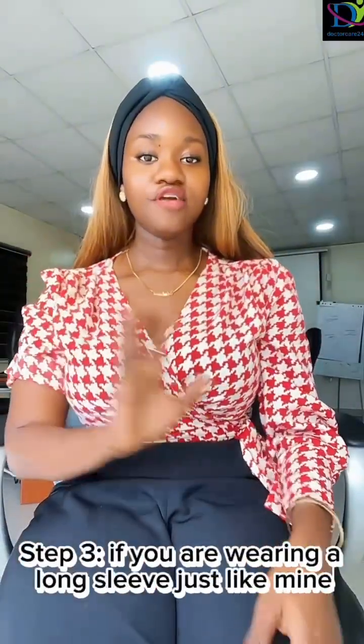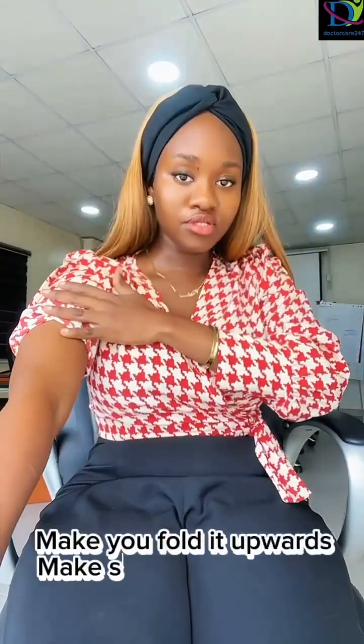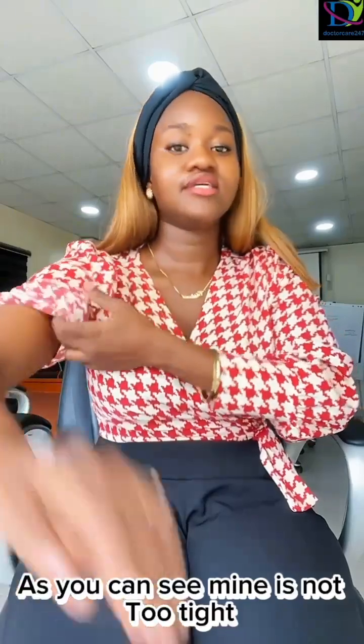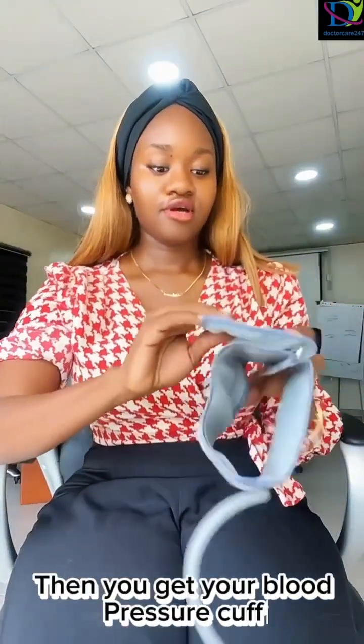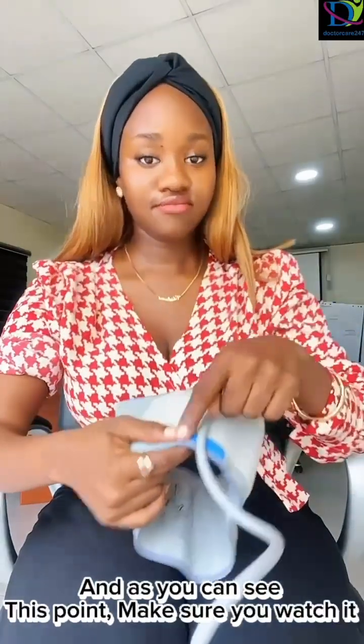Step number three, if you are wearing a long sleeve like me, make sure you fold it upwards, but make sure it's not too tight. Like you can see, mine is not too tight. Then you get your blood pressure cuff and you open it. And as you can see, make sure you watch this point.